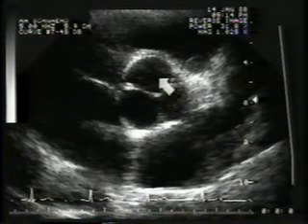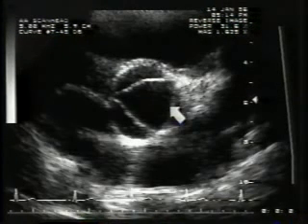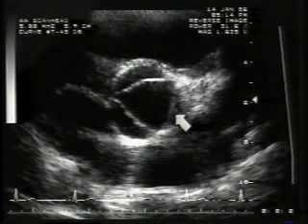The right coronary cusp is adjacent to the right ventricular outflow tract. The non-coronary cusp is adjacent to the right atrium, and the left coronary cusp is adjacent to the left atrium. In systole, the valve opens with a triangular appearance. This feature is crucial in differentiating this normal three-cusped valve from a bicuspid valve. Pay attention to this feature in slow time.